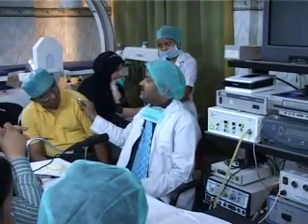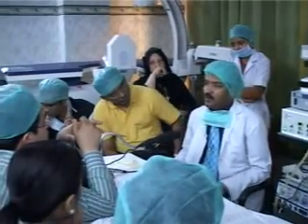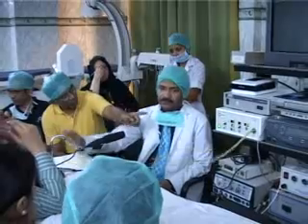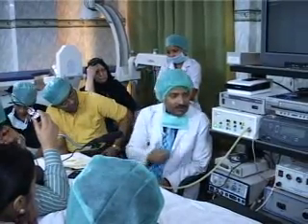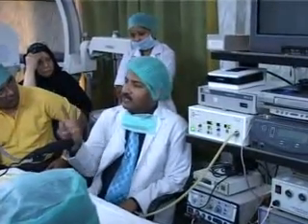Gases coming in impulses, like stop, stop. That's why sometimes here it is 0, sometimes 1. This is pulsatile flow. Why pulsatile flow? Pulsatile flow has two advantages.